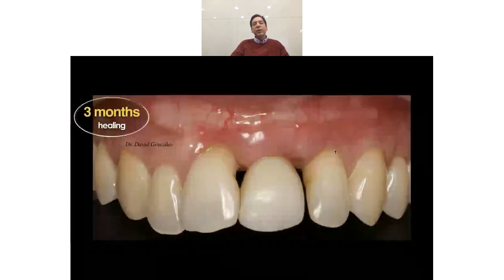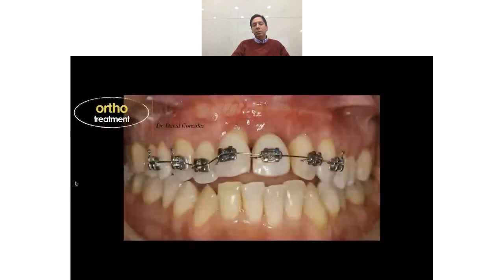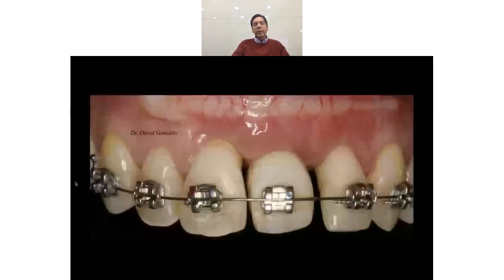And this is the aspect 3 months later. Remember, this central incisor is rotated, this lateral incisor is also kind of rotated, and this is extruded. So it will be an easy orthodontic treatment. All we want is some alignment of these teeth. This is the orthodontic treatment that my wife Hema did in here. And this is after some months of treatment.